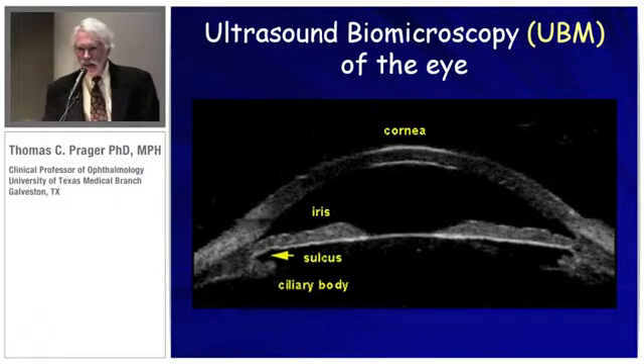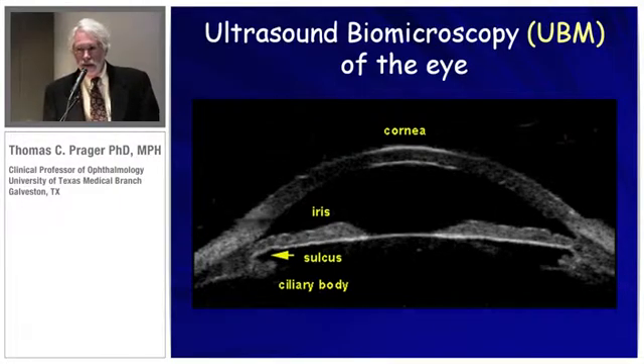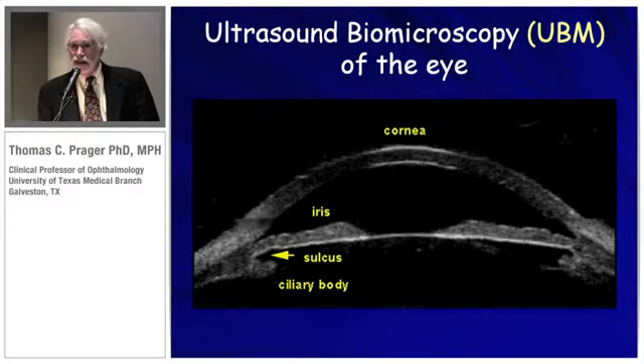We're used to seeing images like this on ultrasound. In contrast to OCT or coherent light technology, we can see behind the iris. We get a very good view of the sulcus and the ciliary body, and this can be accomplished with an immersion type of methodology.